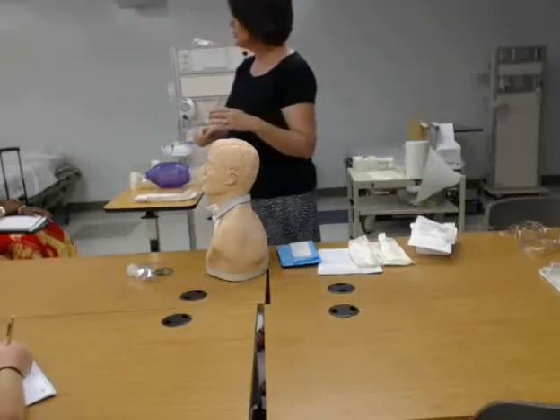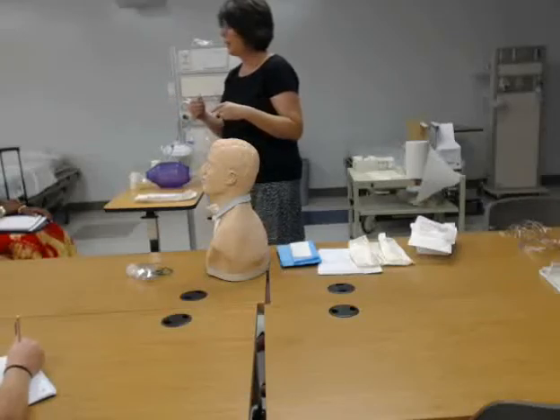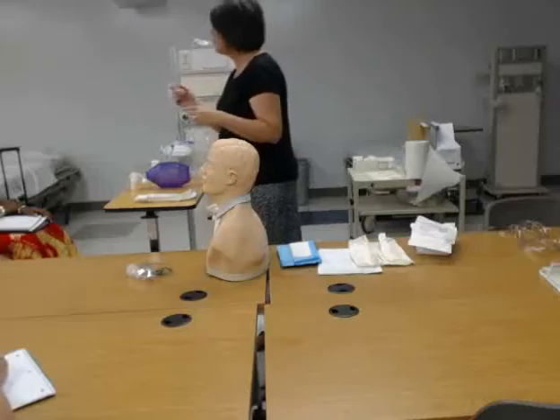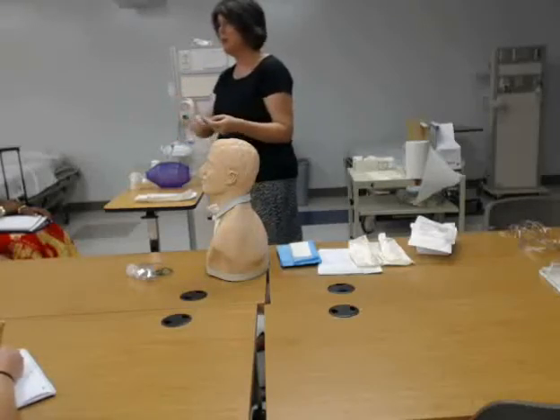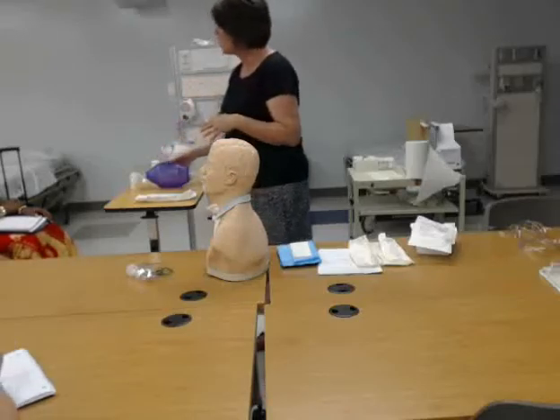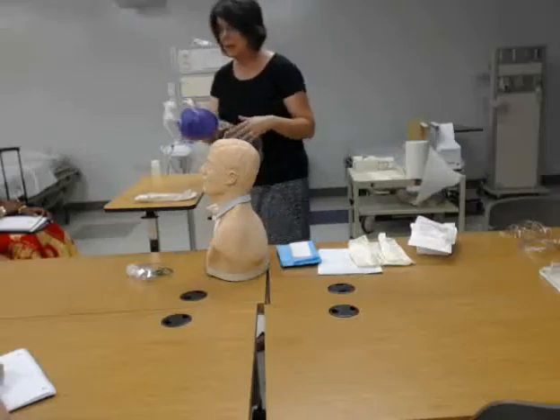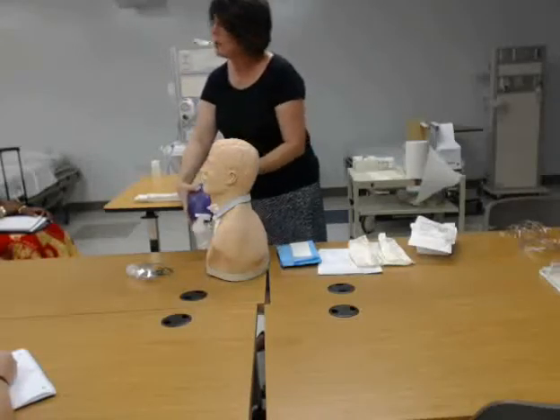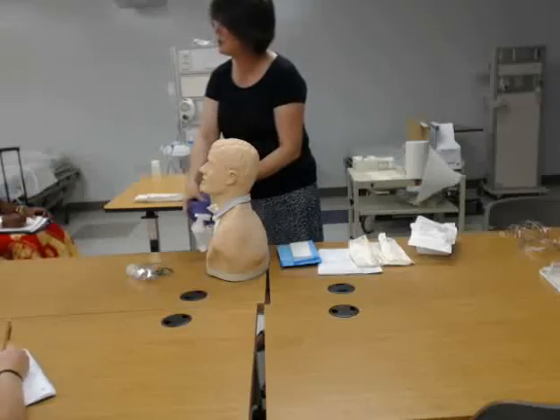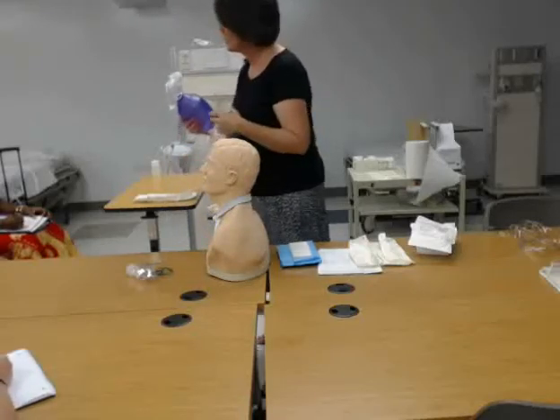Besides secretions when we suction, what else are we going to be pulling out? We're going to be in the trachea, so there shouldn't be any saliva there. We're going to be pulling out oxygen — as we're suctioning, we're also going to be taking out whatever oxygen is in their lungs. That's why prior to suctioning you want to hyperventilate or hyperoxygenate your patient. You do that by attaching your Ambu bag and giving them a few full deep breaths prior to starting. They're hyperventilated, they're hyperoxygenated.